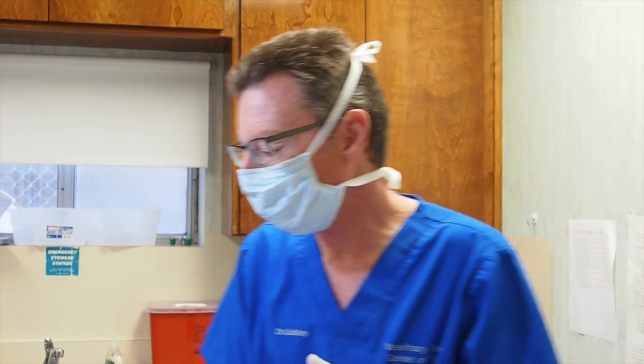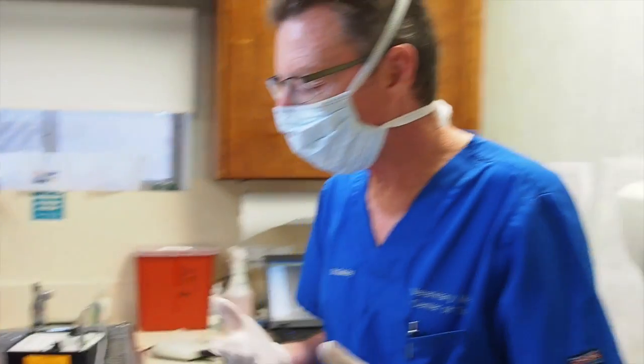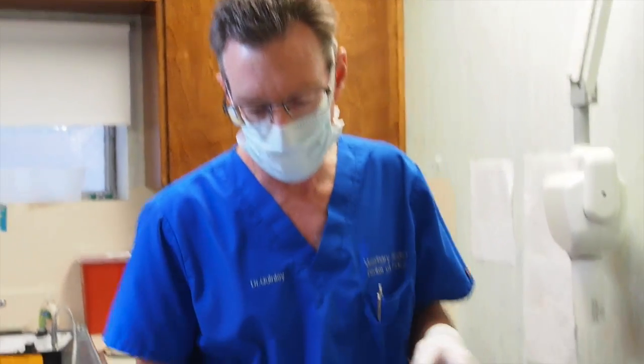And the reason is that we need to get cleaned up under the gum line, which is where the dental disease continues to progress after it gets on the tartar, as we talked about a few seconds ago. So we do several steps. Stacy's charting as she goes along. We have a dental chart here for any abnormalities. We actually found a fractured tooth.